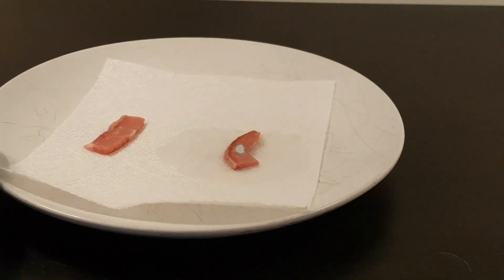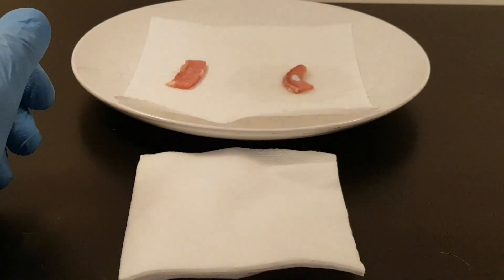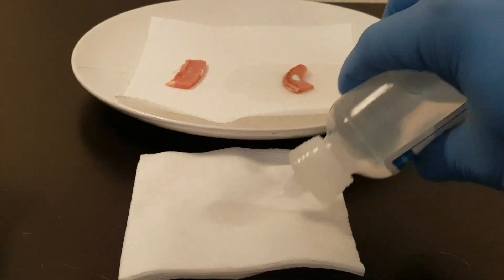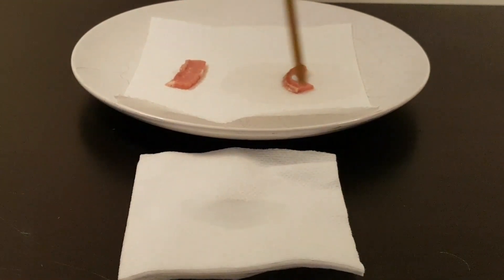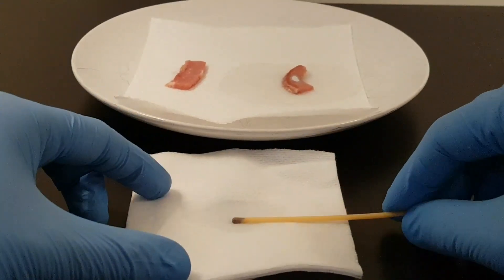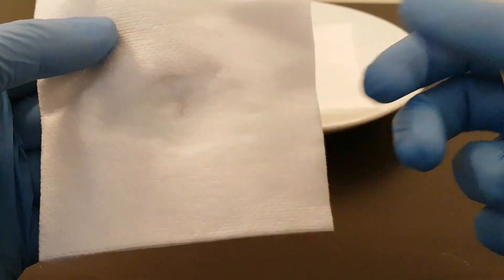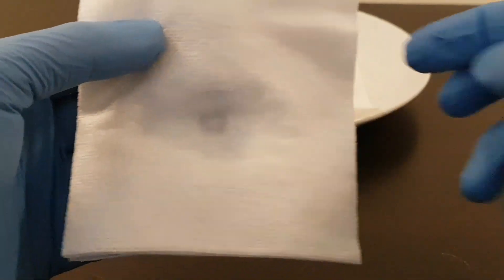The other way you can do silver nitrate is get yourself a piece of gauze. Grab some sterile water and pour it on the gauze to activate your tip before applying it to the wound. Roll it and dab it — you'll see some of the surface coming off on it. Now it's a little whiter, so it's activated and ready to go.